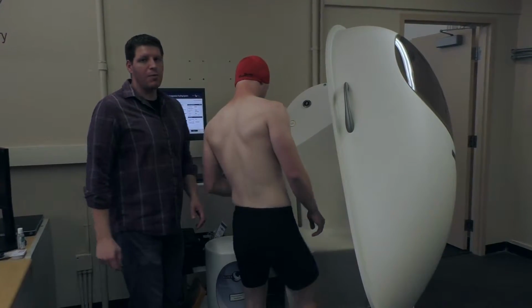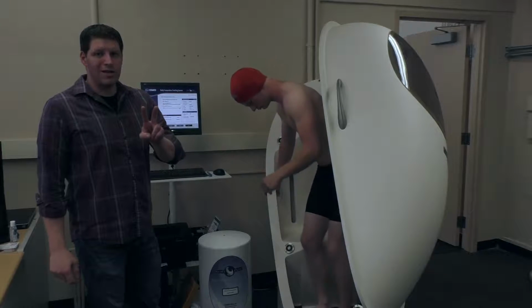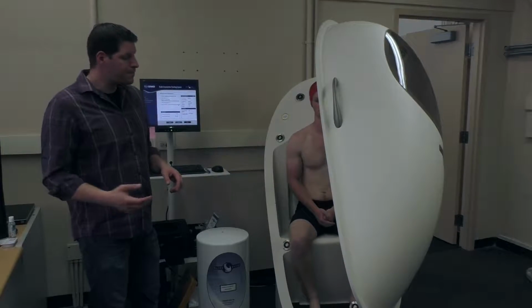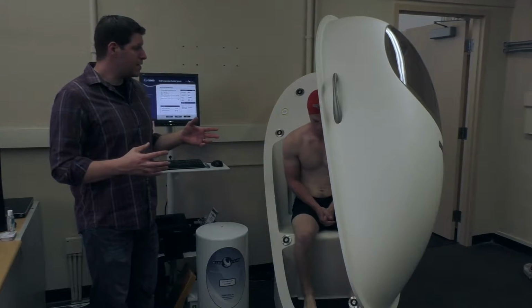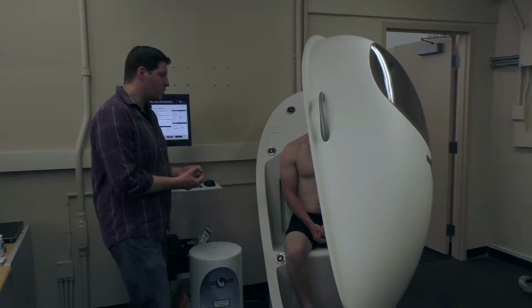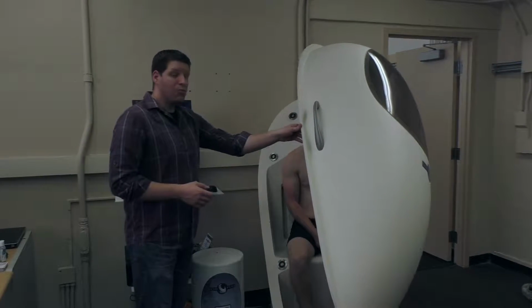And the key went in the bod pod. So we'll do 2 different readings. Each takes about a minute. That's about it. And if those 2 aren't close enough, then we'll have to do a third. But the key here is to ask them to hold as still as possible. So usually we ask them to keep their hands sort of in their lap and to breathe normally.